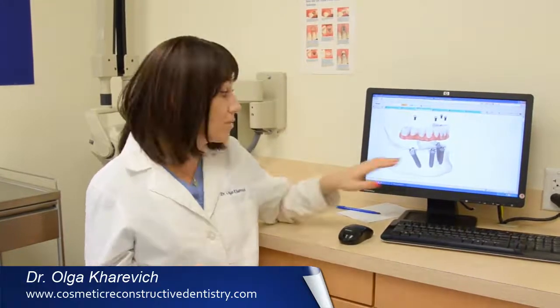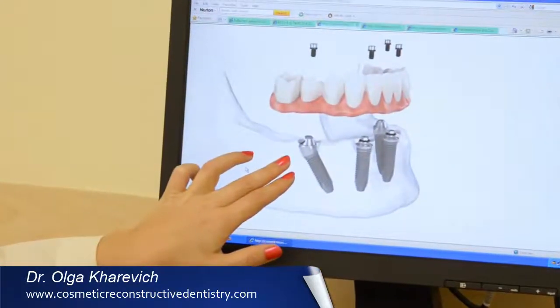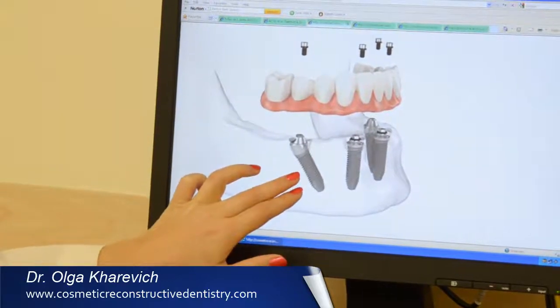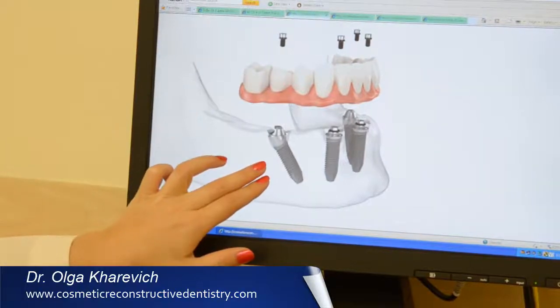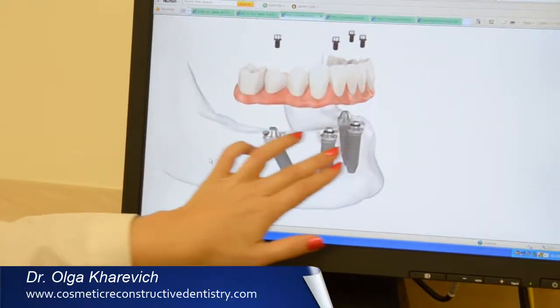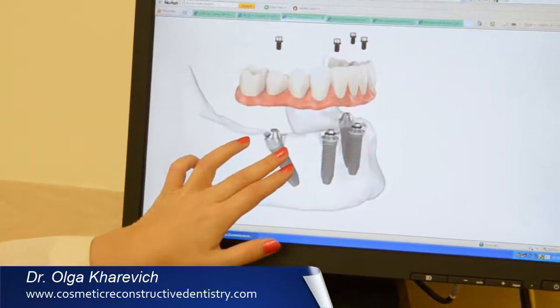the desirable effect. In the situation when the patient has severe bone loss, pneumatized sinuses, for example, the patient was edentulous for many years and has severe resorption of the mandible, which is usually a very limiting factor, we place long implants under the angle, so we bypass the nerve and are able to give in this situation fixed teeth for the patient.